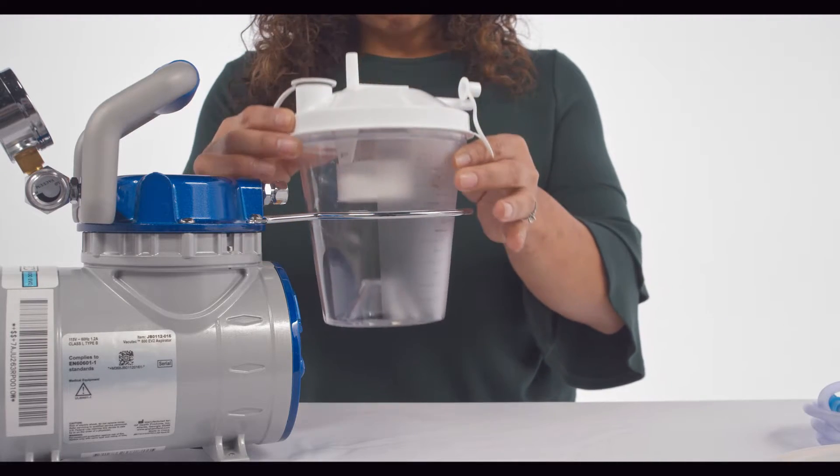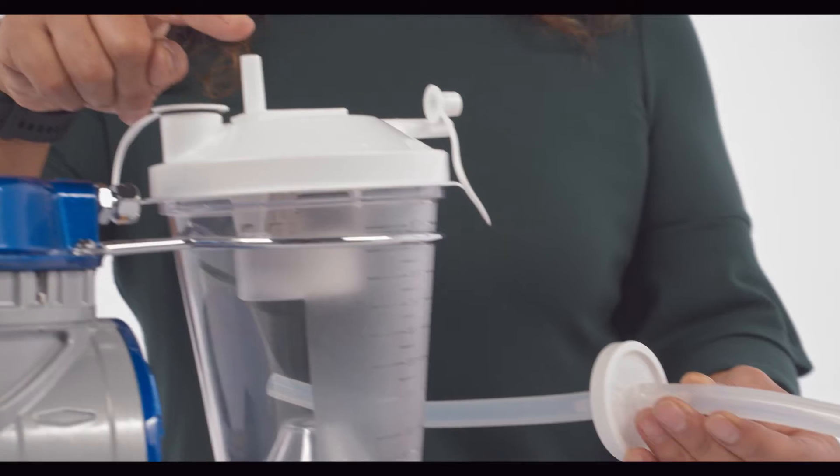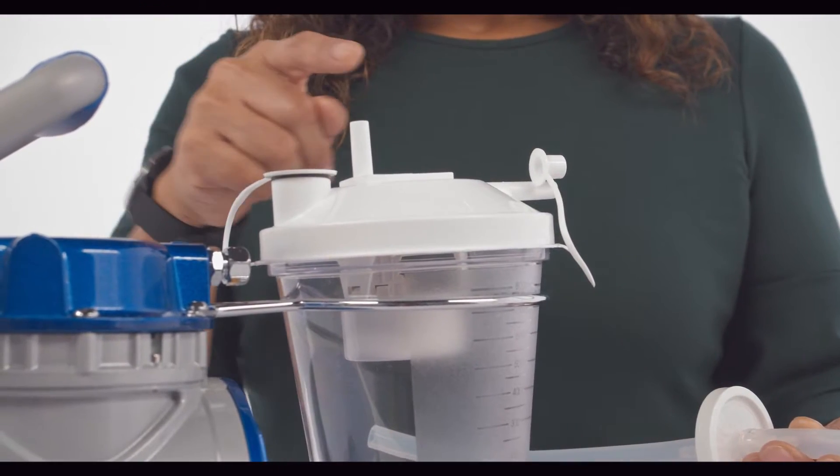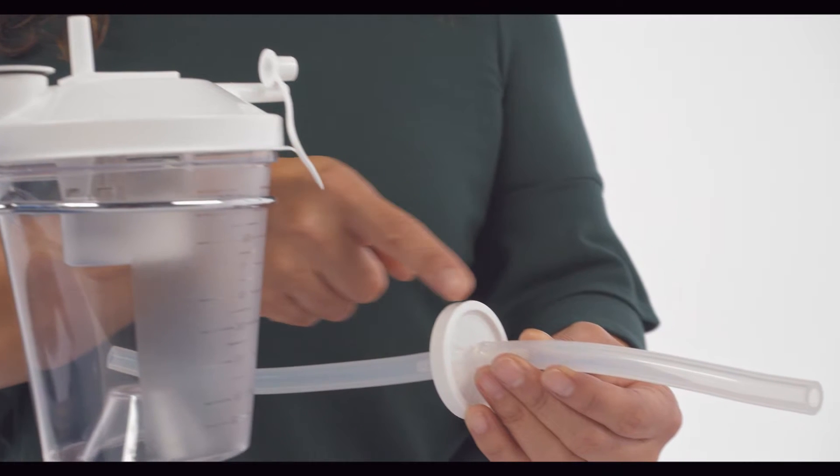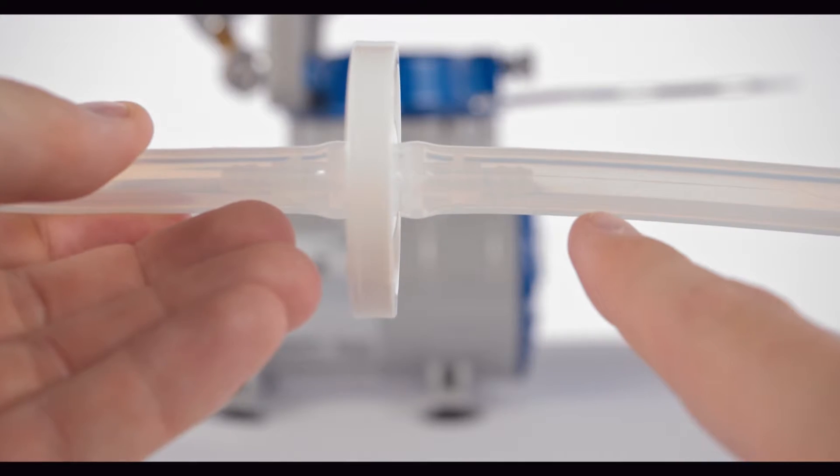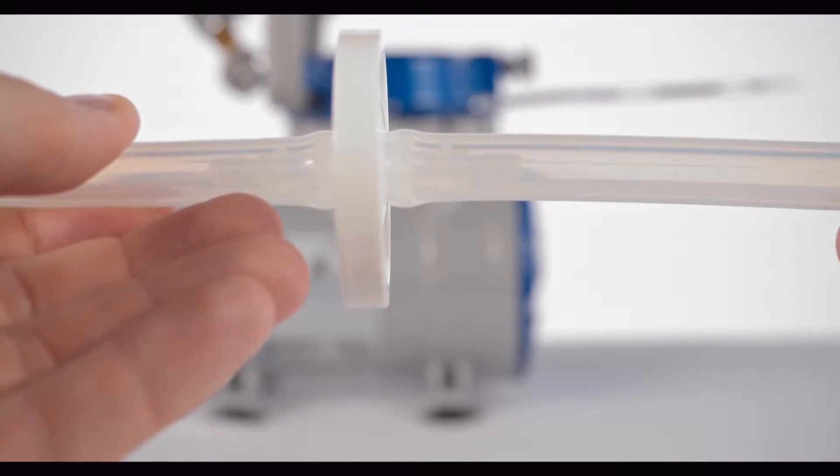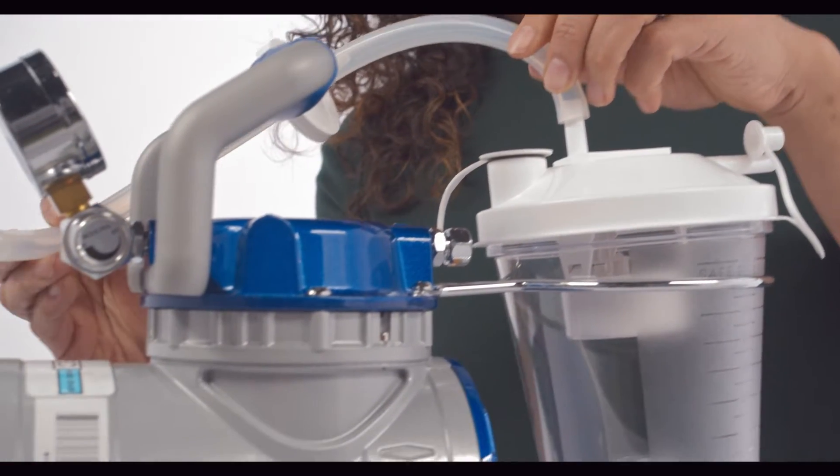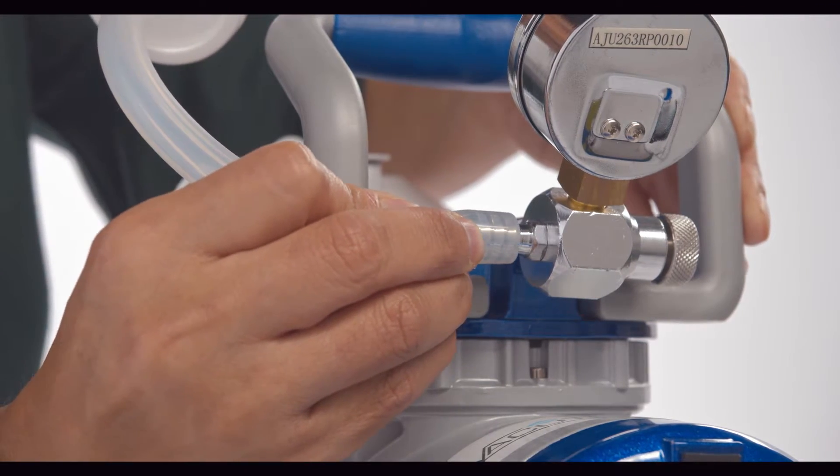The collection bottle will fit in the bottle holder attached to the aspirator. The opening or connector at the top is going to connect to the unit tubing that holds the HEPA filter, which allows the unit to suction and prevents particles from backflowing into the compressor. One end of the tubing will connect to the top of the canister, and the other will connect to the suction machine.